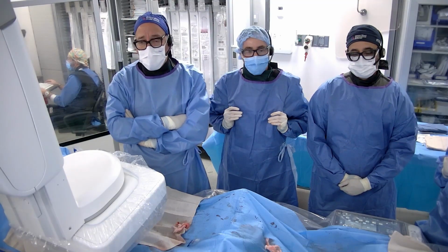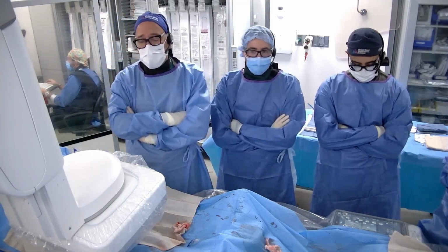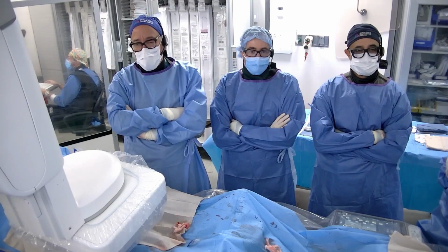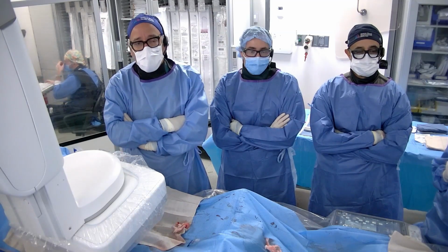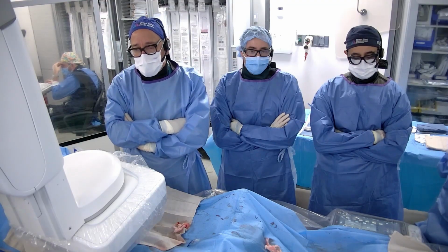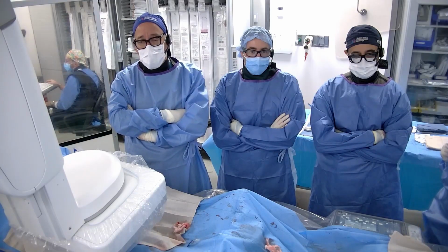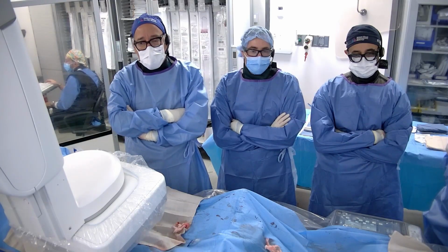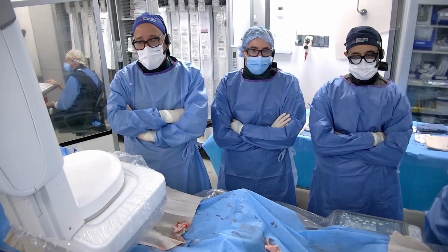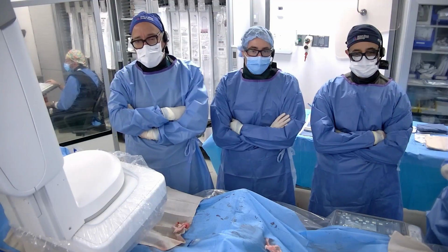So your plan, just so we can sum things up here. Yeah, absolutely. We're going to aspirate the entire length of the SFA and POP. As per the previous comments, we'll probably swing from the origin of the posterior tibial into the origin of the peroneal. In full candor, I don't think I'm going to spend that much time on the peroneal just because I'm not sure that the benefit is really going to be there. If I can get a durable single vessel into his foot, I'm going to alleviate his rest pain, and I think he's going to feel better.